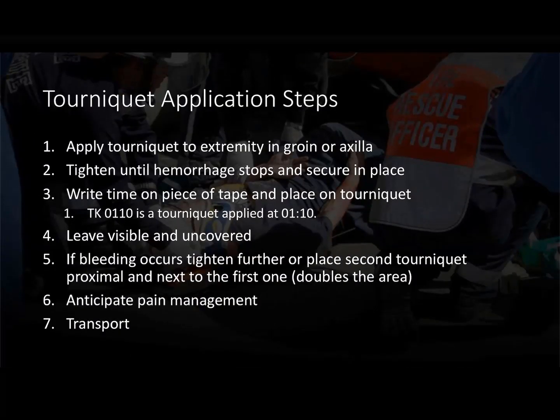Some steps in applying tourniquets, very easy to use, but I do recommend that you practice using this. You should also practice applying tourniquets to yourself because the incidence of violence against first responders is increasing across the country. When we apply the tourniquet, you want to apply it high in the extremity, as close to the core as you can, so high in the groin or high in the armpit or axilla.